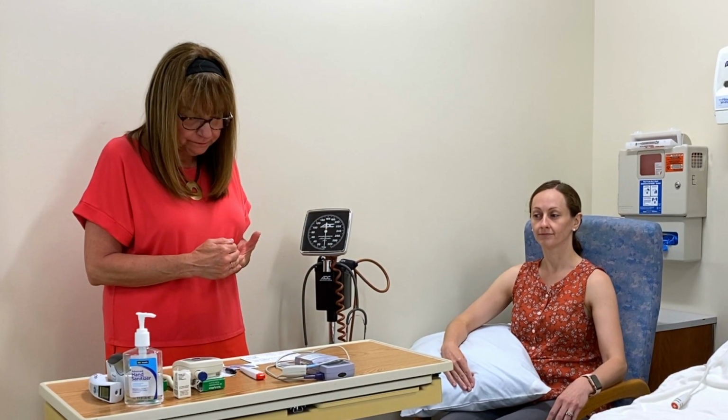We're also going to teach you how to palpate a blood pressure before you take the patient's blood pressure, so that you can get a baseline blood pressure and know how high to pump it up. Remember, when you put a cuff over an artery, it's a tourniquet. It's obliterating all sound, so that when you hear the first sound thumping, it's your systolic. And then your diastolic is the absolute last sound that you hear.